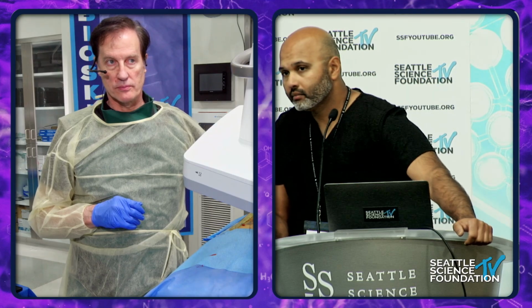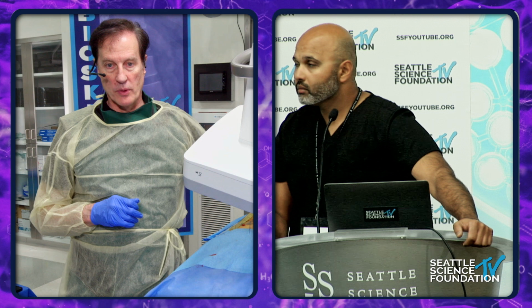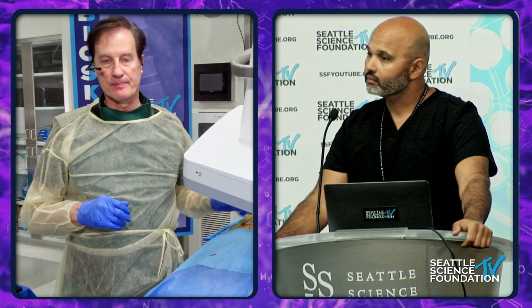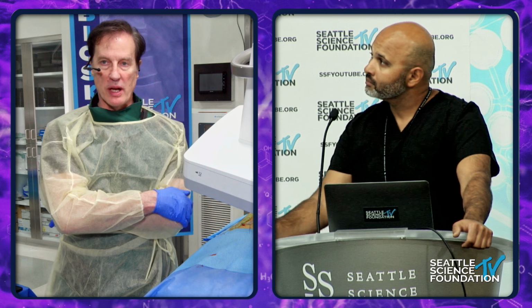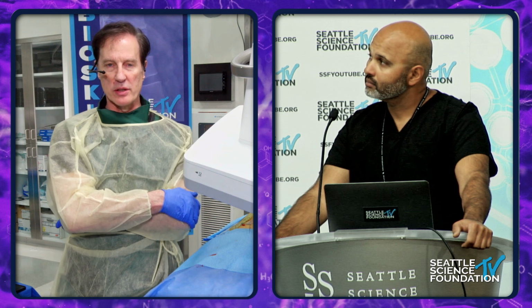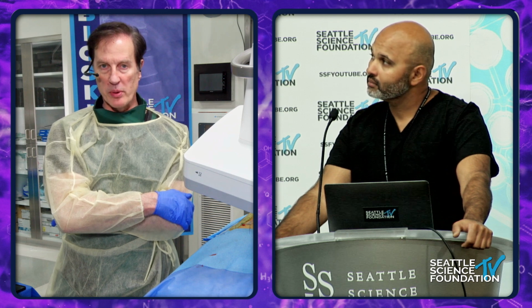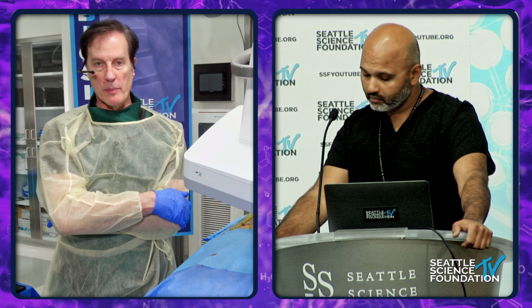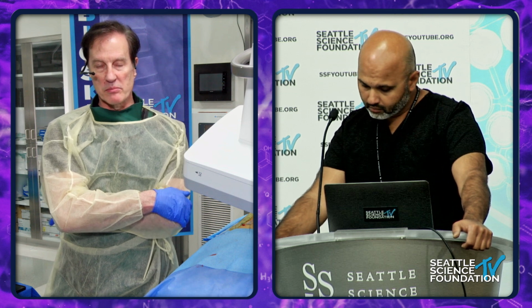Questions? Yep. Is there any preference whether to do it lateral or the posterior approach? There's a little bit of biomechanical benefit to going lateral as compared with posterolateral, but the biomechanical papers, to be really frank with everyone here, are based on a single posterolateral implant as compared with either a posterior implant, a very vigorous one that we're about ready to see Dr. David demonstrate, or 3 lateral implants. And so that biomechanical data may or may not be true.